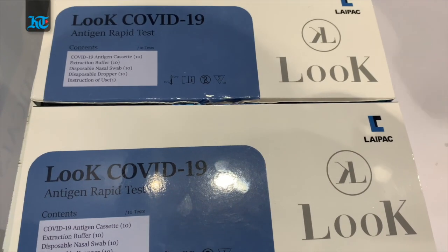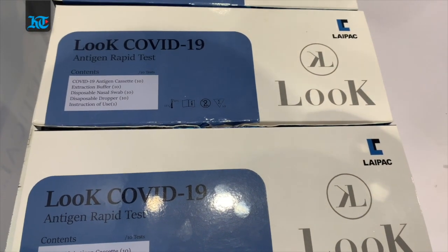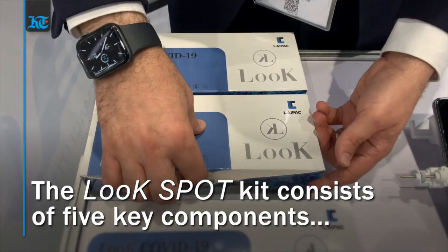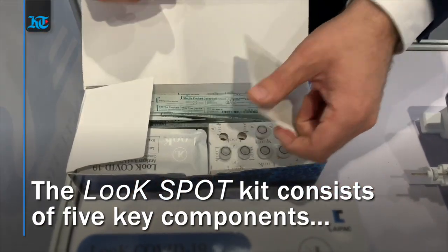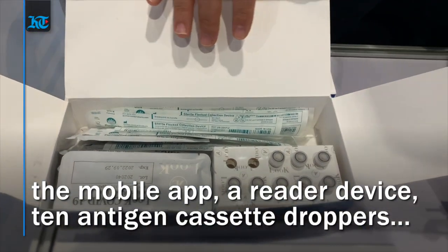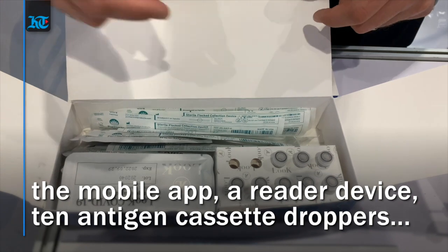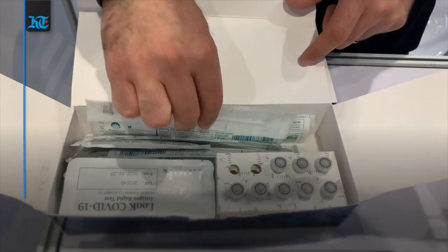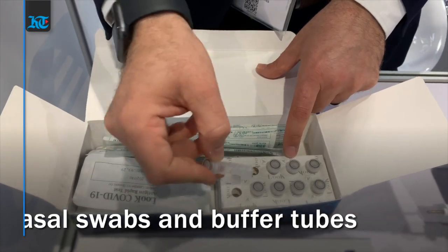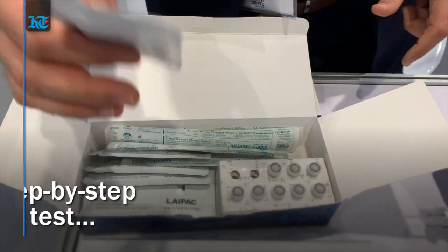Hi everyone, we are here to show you how to do the COVID-19 antigen rapid test from our LOC-COVID-19 kit. The kit is called LOC-COVID-19 and contains a total of 10 cassettes, 10 tests, and the swab, the reaction buffer for each sample, and the cassette for each sample.